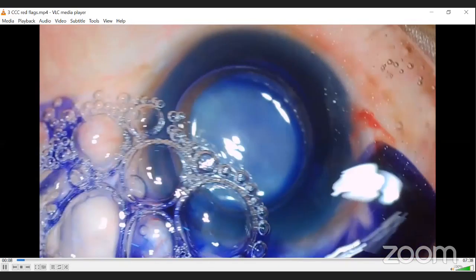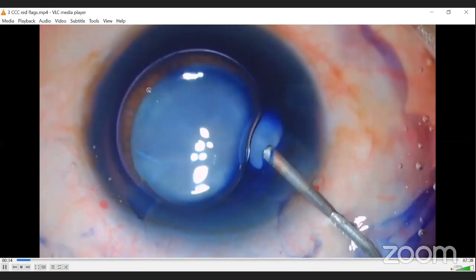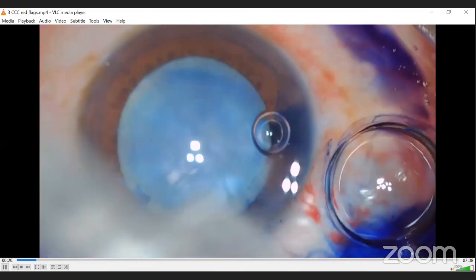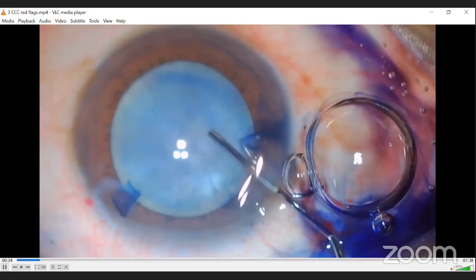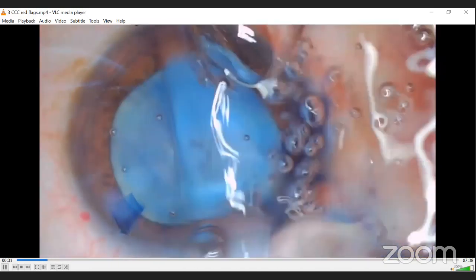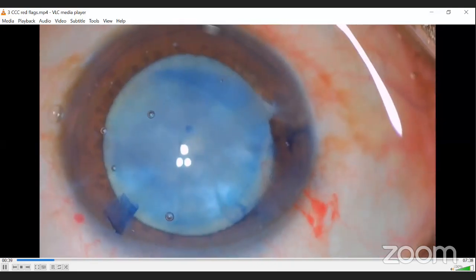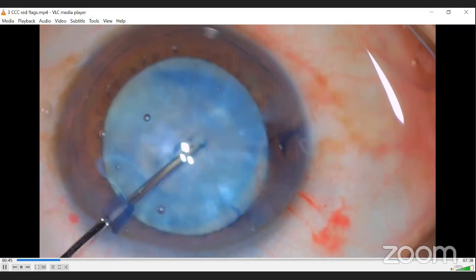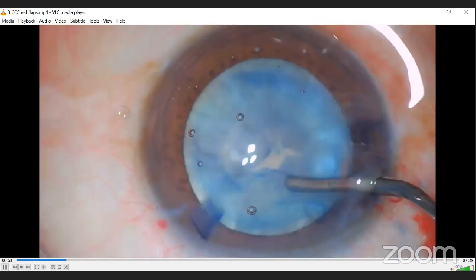Let's have a look. So it's a case of white mature cataract, a little bit intumescent. So I'm going to follow the same principle which I explained. I've just fast forwarded this video because we want to go directly to the red flag. I'm using sodium hyaluronate here, the soft shell technique. The cruciate punctures will be made on the anterior capsule. Then I will aspirate the intralenticular fluid from both sides, remember. Then I will flatten the anterior capsule by giving the stroke using the visco cannula.